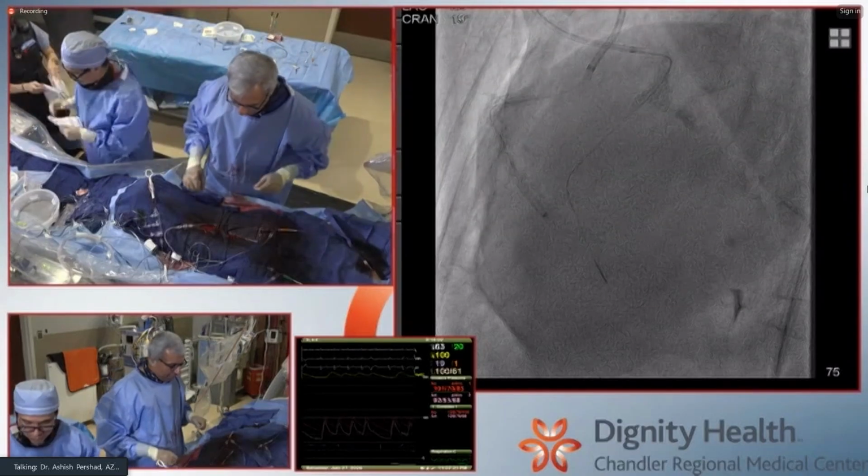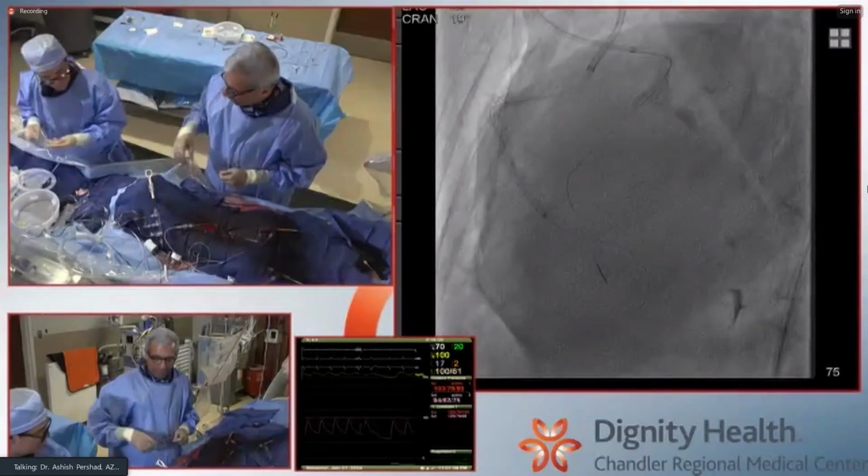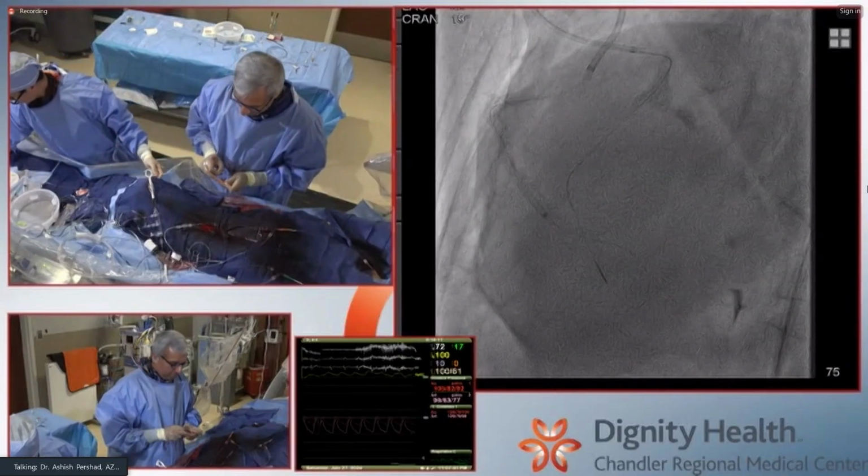So I'm happy that. Absolutely. 1 hour is good enough for a CTO, I think. We're all excited to see your final result, though. You've sort of seen most of it, just a distal touch up at the end.